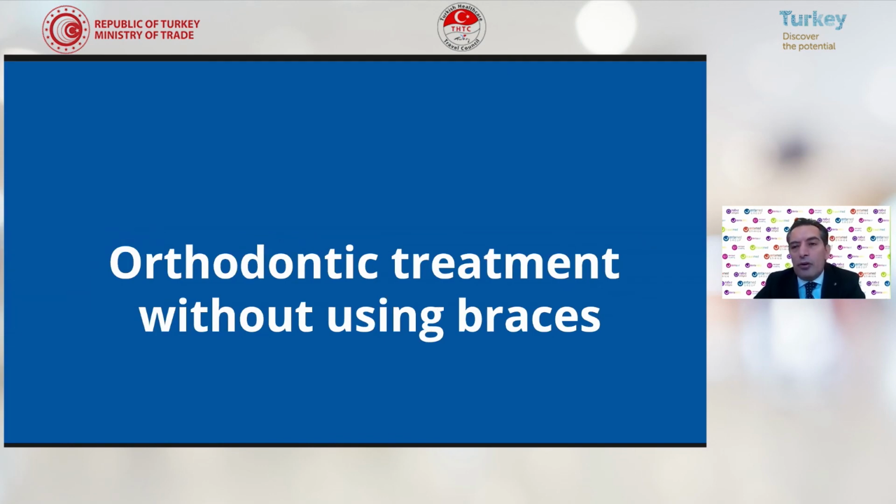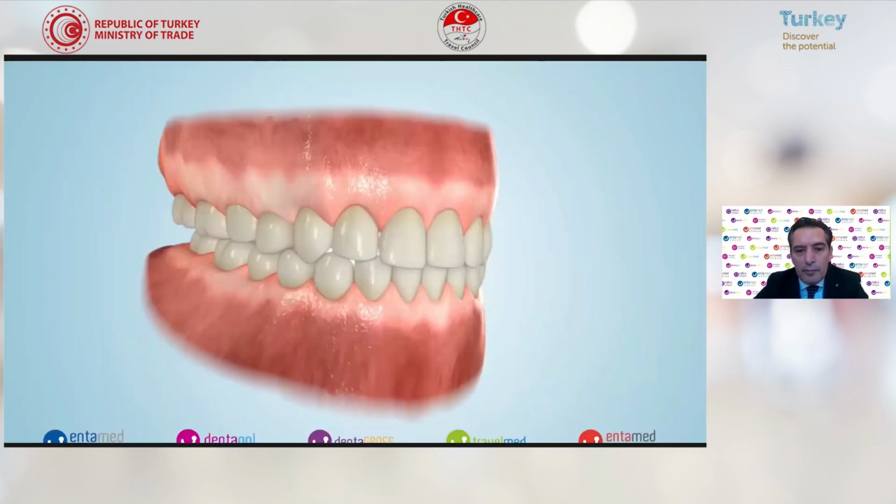Orthodontic treatments are also important, but for patients, braces are really something that they don't want. While using these braces, the patient doesn't want to see them and doesn't want any metal thing in the mouth. So we are using aligners for these kinds of treatments now. You see, this patient has problems.